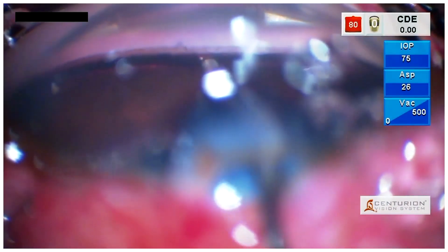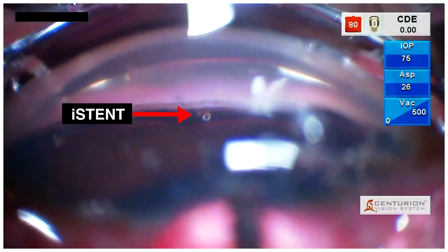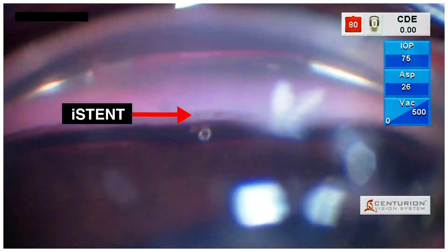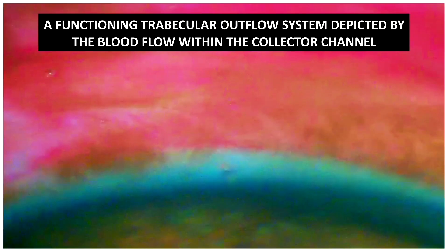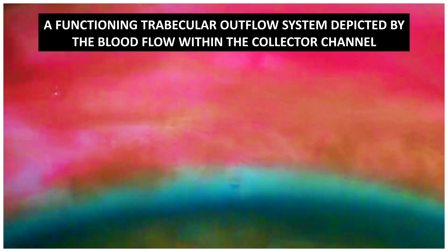Following which, we can release the trocar and assist the stable placement of the iStent within the trabecular meshwork. A functioning trabecular outflow system can be seen by the blood flow within the collector channel from the position of the iStent.